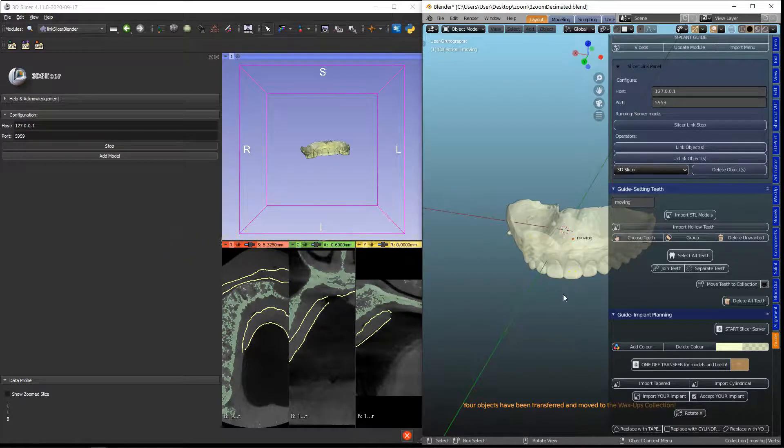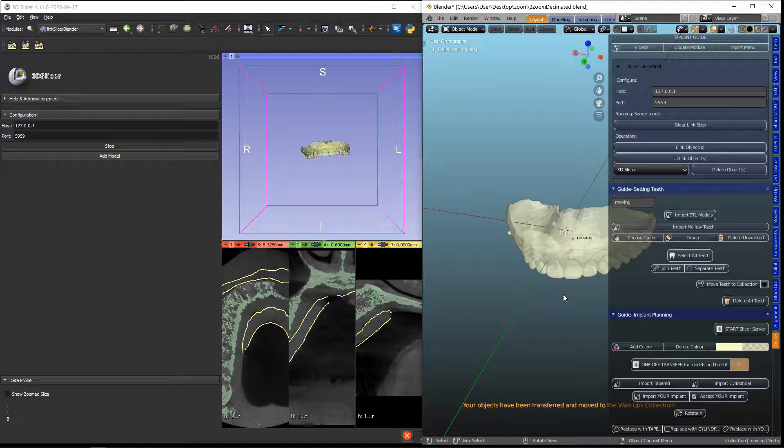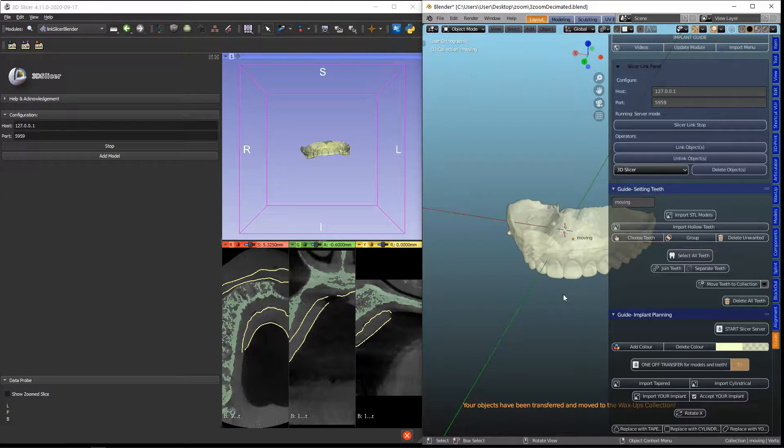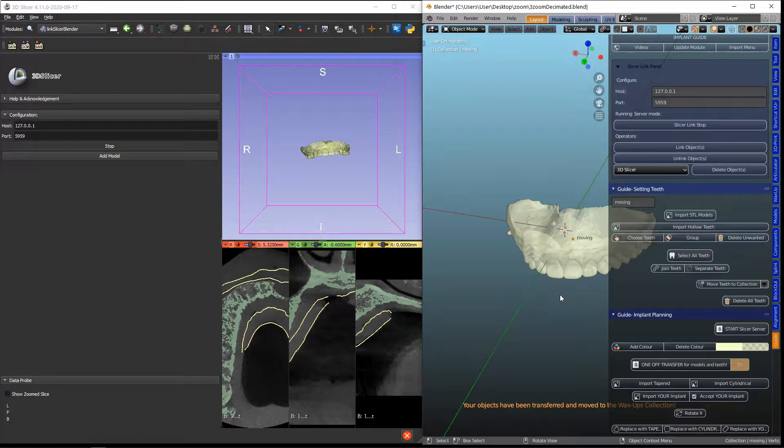During our implant planning, we only want the implants to transfer and nothing else on the scene. This is also why we've deleted the ICP segmentation model.